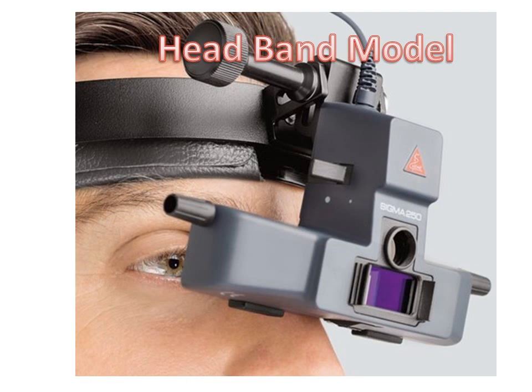You must know that the teaching mirror is extremely useful in learning, especially when a retinal detachment case is being assessed, which is difficult to assess by a junior doctor. A senior doctor can easily teach him through the teaching mirror which is present in the indirect ophthalmoscope.